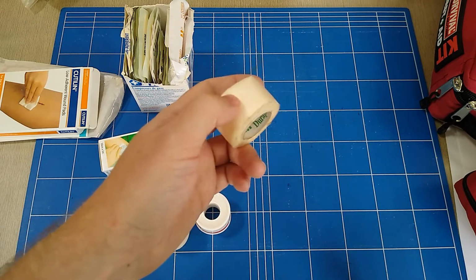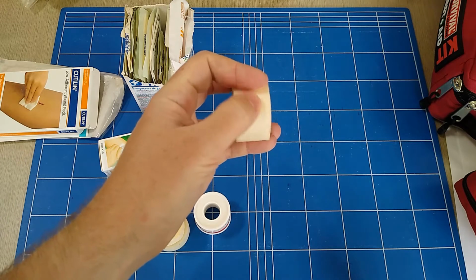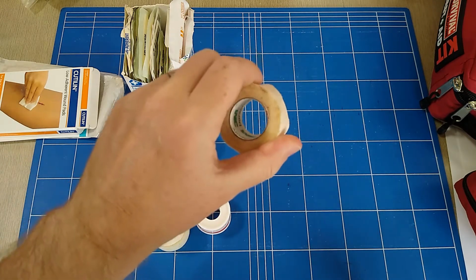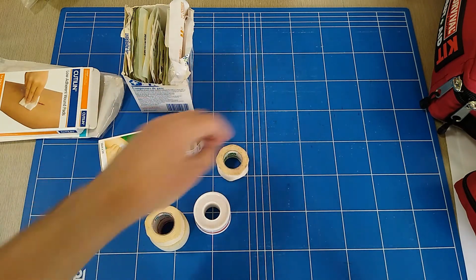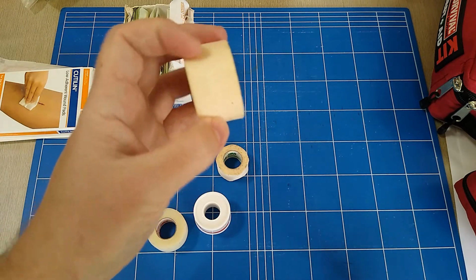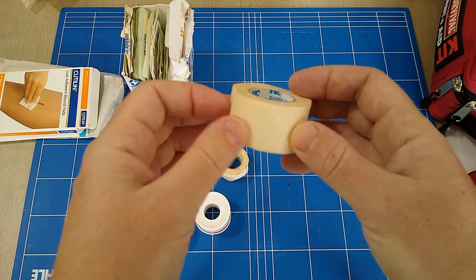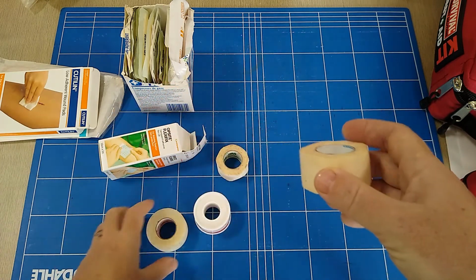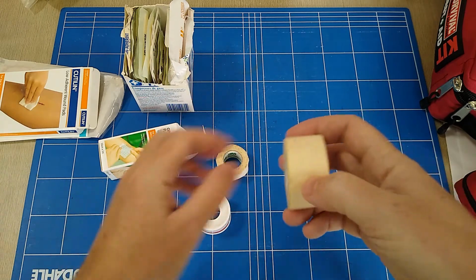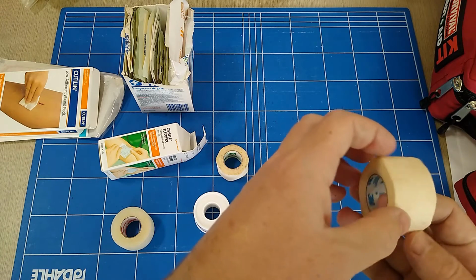I've used it to cover blisters. It's not super ideal for that because it does have a pattern to the cloth, so it doesn't rub freely in both directions, but it sticks monstrously well. Then we've got various kinds of paper tape, like this micropore. Okay? This stuff has seen some heat, so it's a little bit shriveled up. And we've got transpore. Both of these are easy to tear tape, but they don't stick super hard.